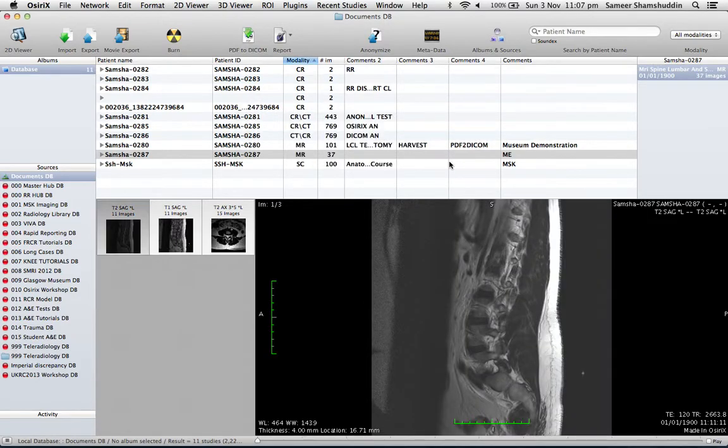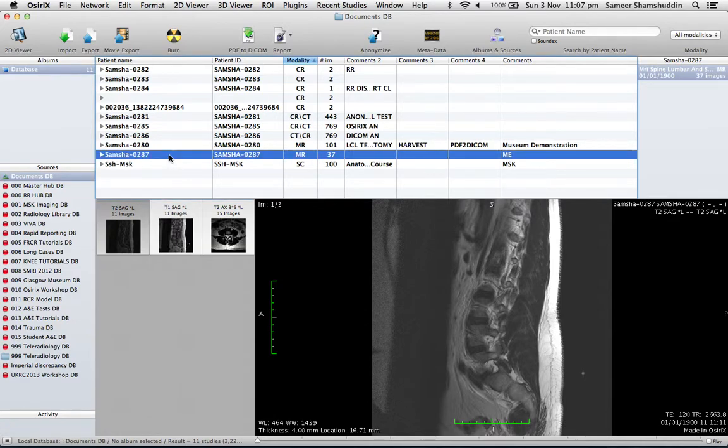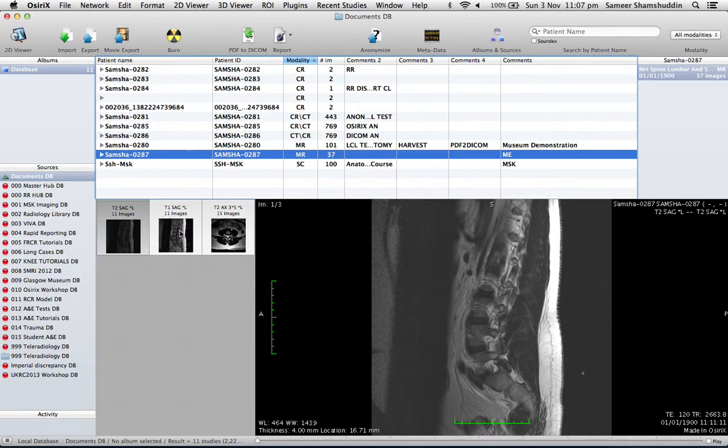And that will get rid of the localizers. But in an ideal teaching scenario, I would like to have my T1 sagittal before T2 sagittal, and then the T2 axial. So how can I move these sequences around so that they all appear in proper order?